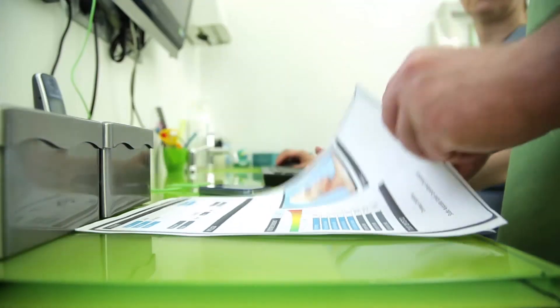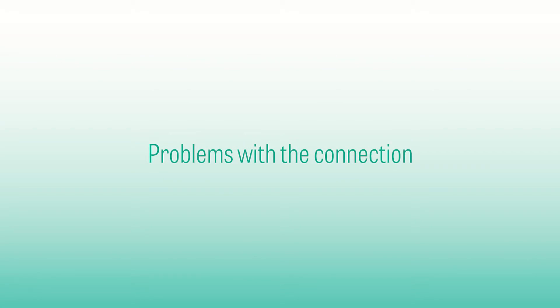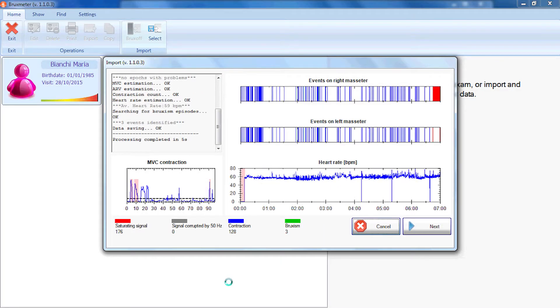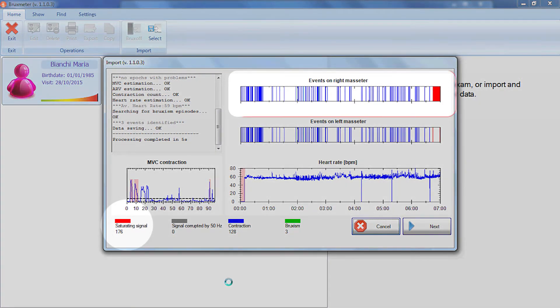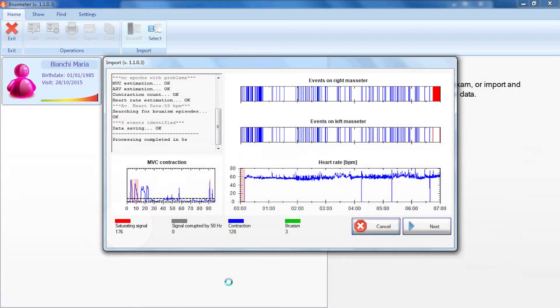The Bruxmeter software can identify problems with the electrode connections and shows them with the colors red or gray. In this example, the electrode on the right masseter became disconnected a few minutes before the end of the test. The graphs can still be accepted.